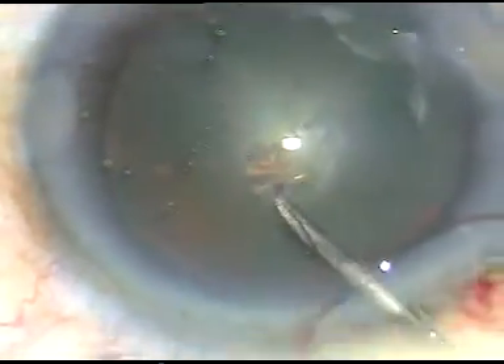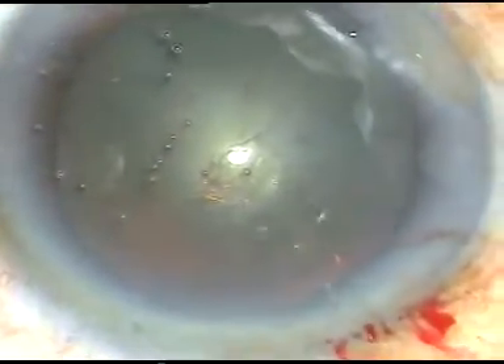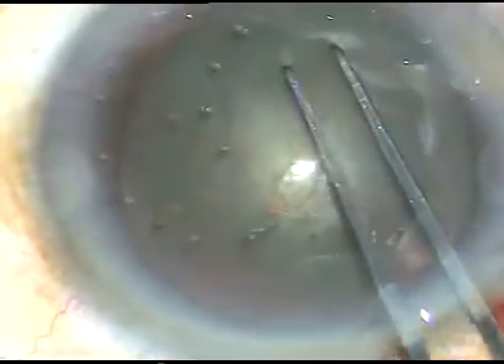In soft cataracts, what I do is: I do hydrodissection, I do a rexis of adequate size — a little larger, say about 5.75 to 6 mm.